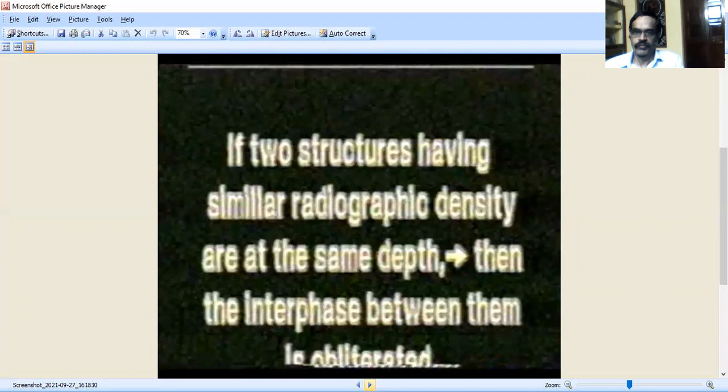So the points are the trachea, then lung parenchyma, then cardiothoracic ratio, then mediastinum and hilar shadows, costophrenic angle, cardiophrenic angle, diaphragm, hemidiaphragm, and any coin shadow, any consolidation or infiltration, or fibrosis. Pleural effusion. These are all to be noted in a chest X-ray.